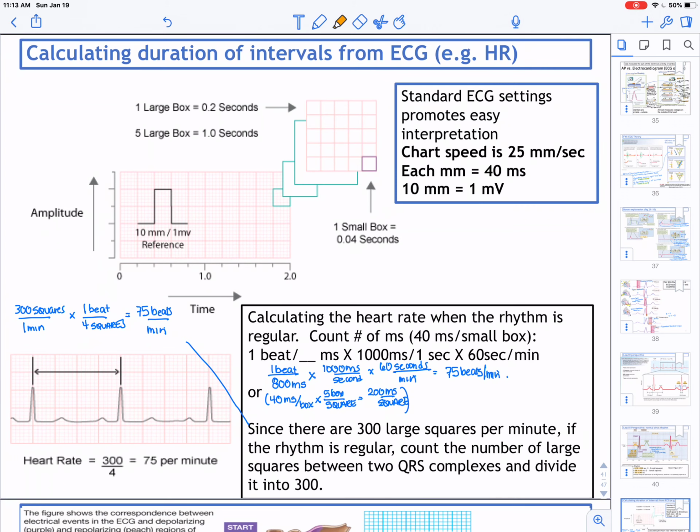And then we talked briefly about how we use this data to calculate heart rate, and I wanted to let you know there are standards, so that if you have a heart issue and you're in China or Peru or Africa or New York City, you can expect that the conditions for measuring the ECG are standard.